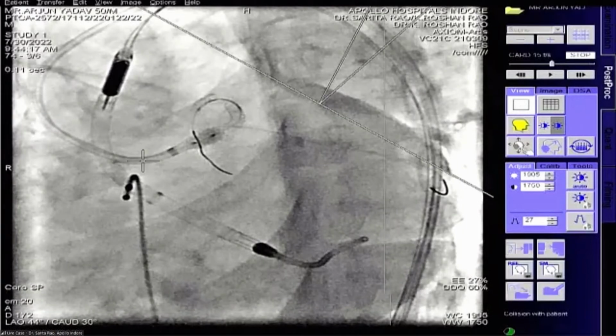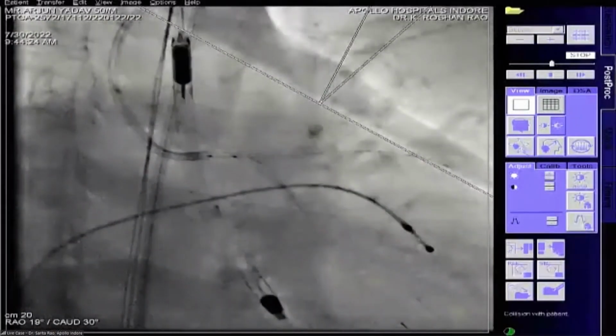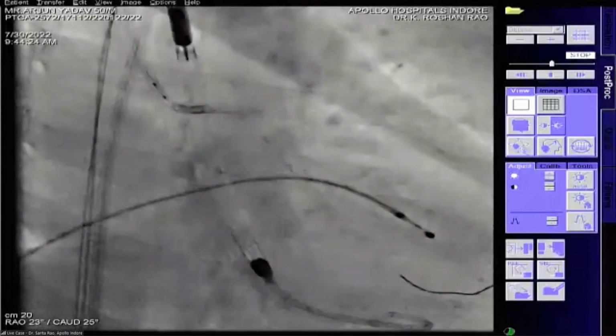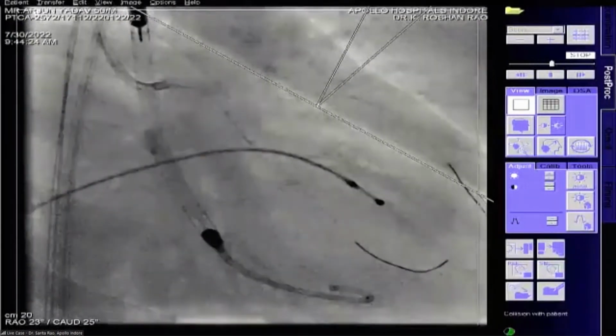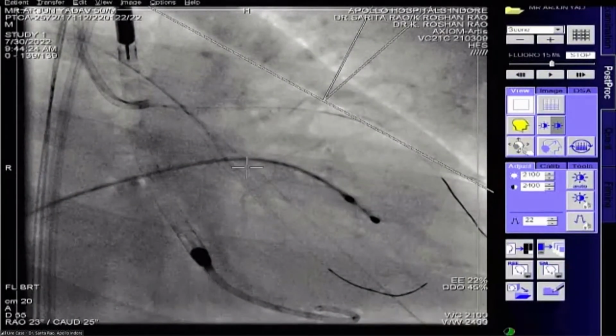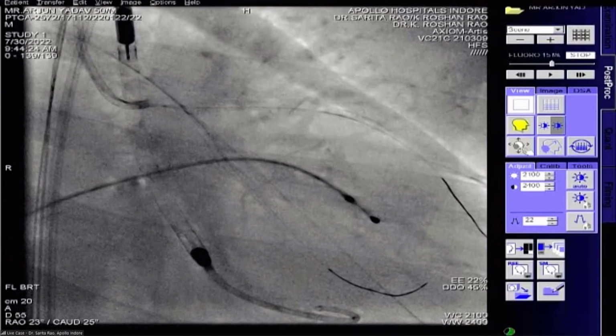I mean, if you want, you can go up to the carina. A little more distal also, you can go up to the carina. That's what sir is telling. So what is recommended generally is to be up to the proximal portion of the origin of LCX. Don't cross it, because again plaque shift. So if you do the proximal portion, then it gets optimized there. I think that's what she tried to do.